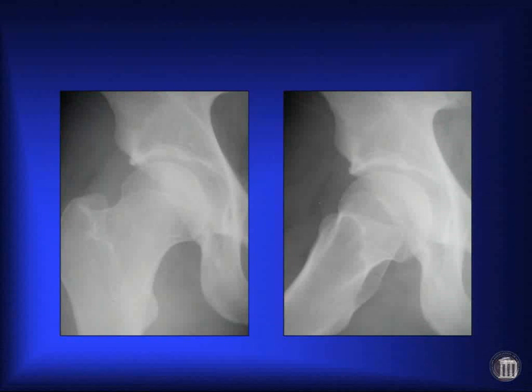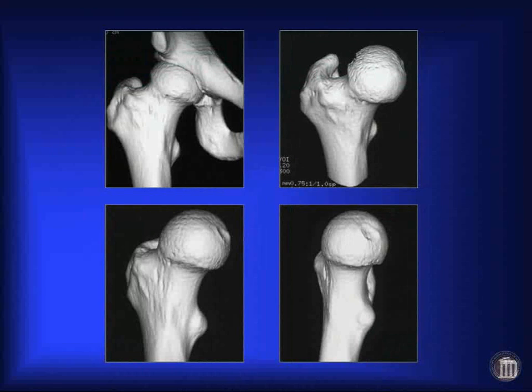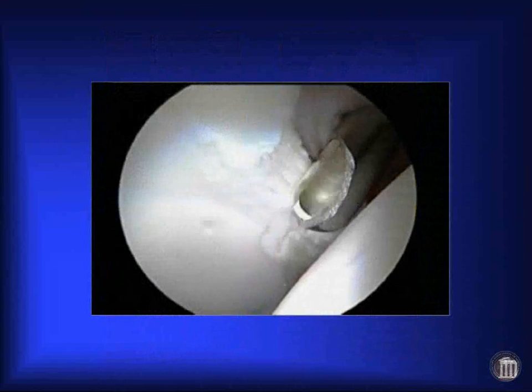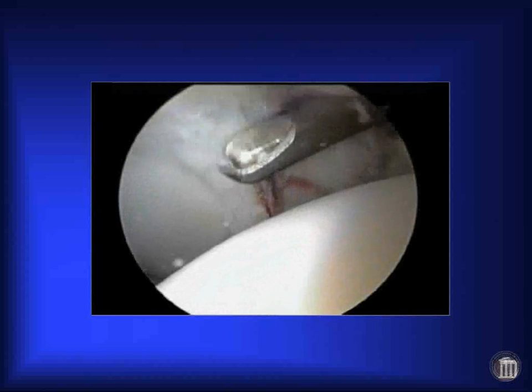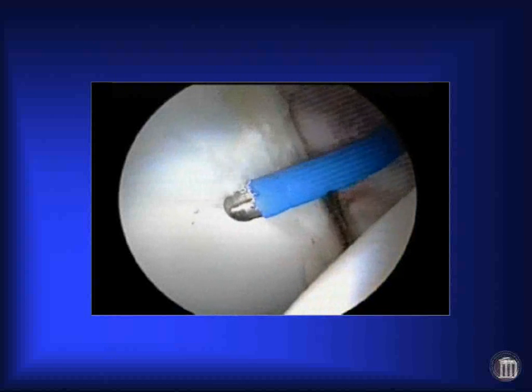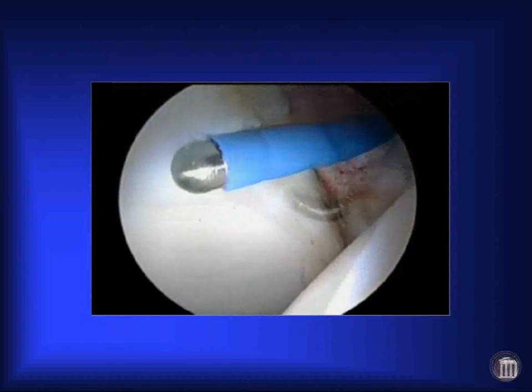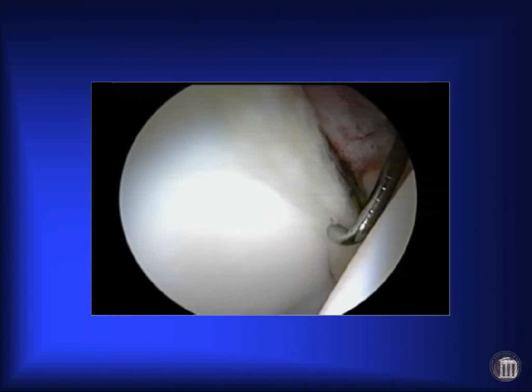This is another illustrative example, a 34-year-old NHL hockey player, been in the league a dozen years. He's got evidence of a labral tear, CT scan suggested cam impingement. Arthroscopically, it turned out he just had a big hypertrophic labral tear that we debrided, no articular damage, no arthroscopic findings of cam impingement. So instead of taking 4 months to recover, he's back playing in 3 weeks. So we don't address the x-rays, we address the findings at arthroscopy.